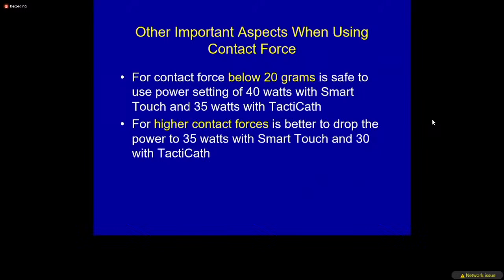And you have to know your electrode. Tacticath, smaller electrode, higher density current, as Susan mentioned, whereas the J&J catheter is a bigger electrode, so you have a little bit more freedom in going up with the power. Today, some of this is a moot point because Medtronic has a diamond tip, J&J has a QDot.